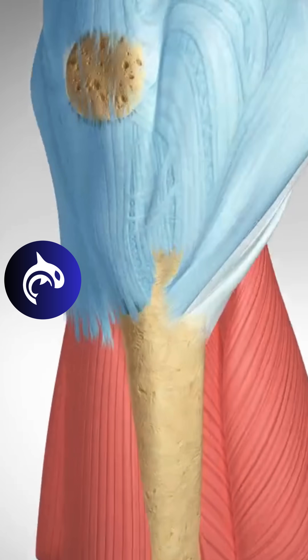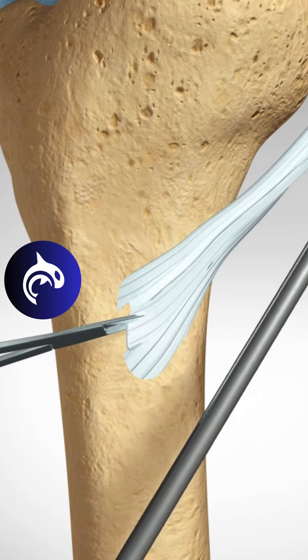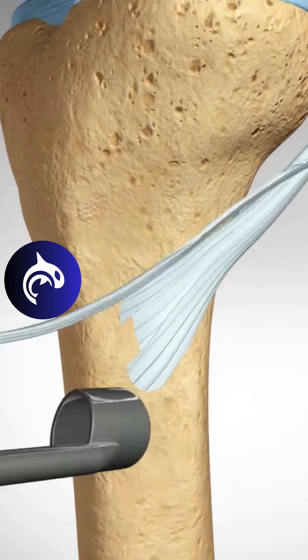Another option is using the hamstring tendon. The surgeon carefully removes a portion of the semitendinosus tendon and prepares it for implantation.